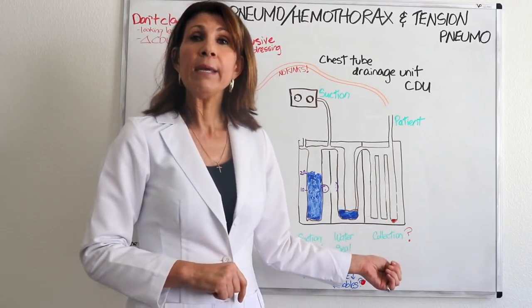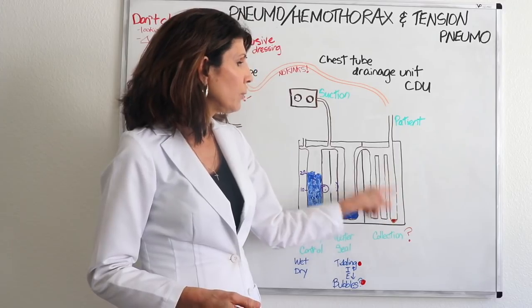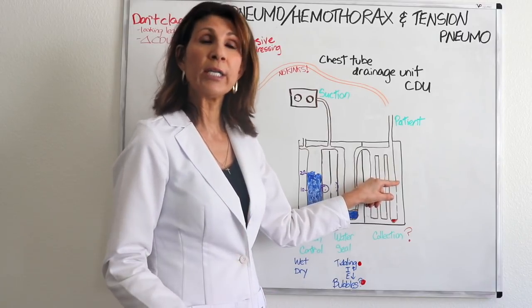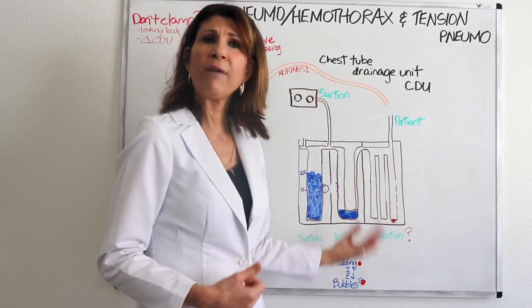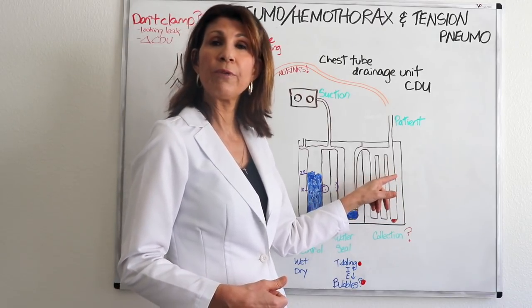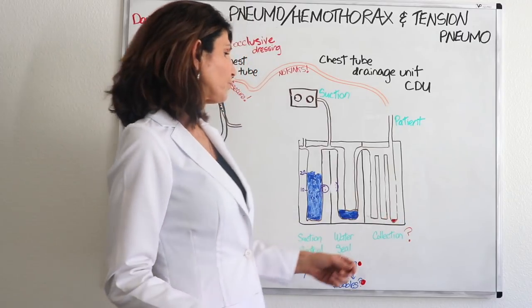If you're resolving a hemothorax and you know blood is expected to come out, you are to mark the little gradations on the collection chamber so you know exactly how much output there is and how long it took for that output to accumulate. After thoracotomy surgeries, when chest tubes are put in, it's an ongoing measure of the output from that pleural space. So it's an important chamber, especially when there is actual fluid coming out.